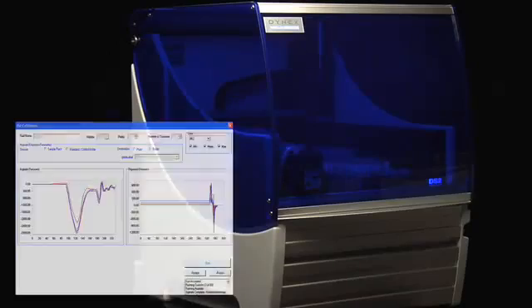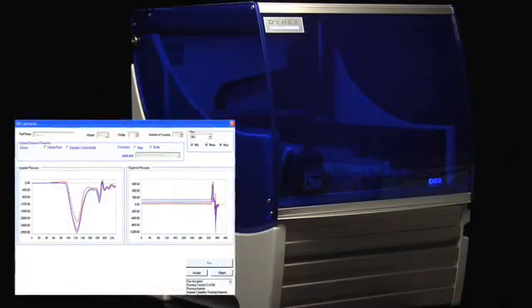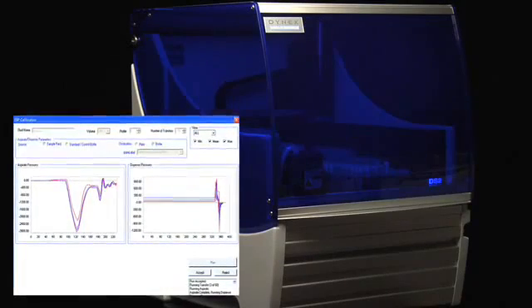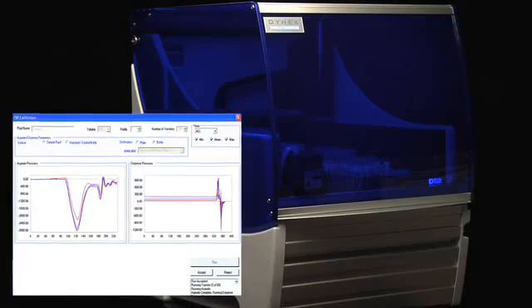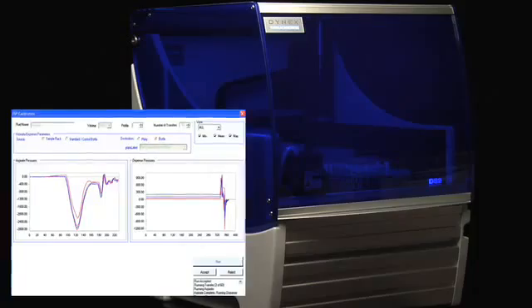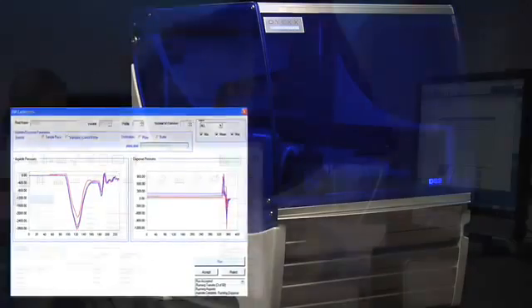And Dynex's patent-pending electronic signature pipetting, ESP, which detects clots or debris to prevent inaccurate sample transfer.